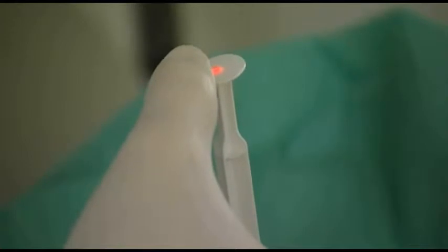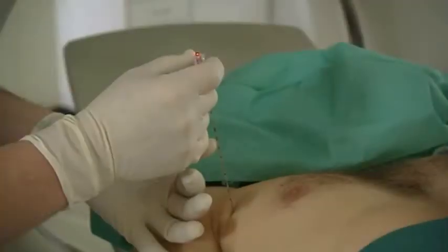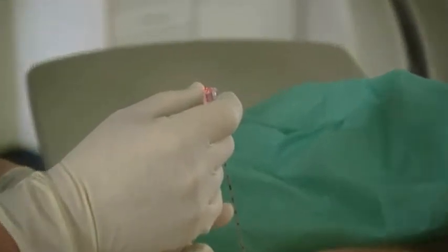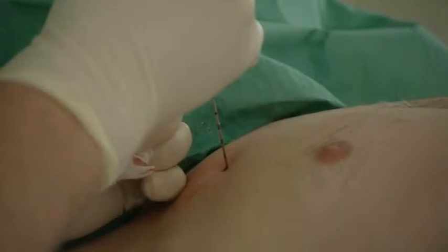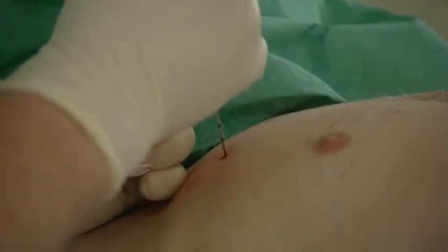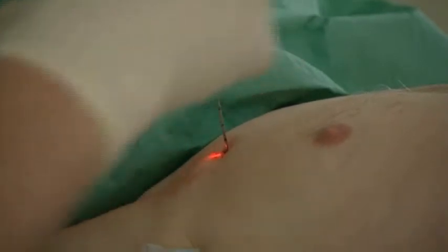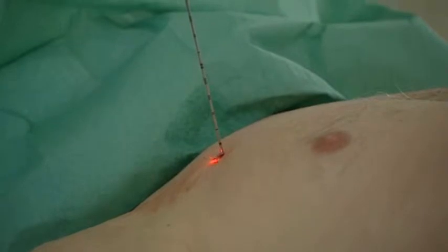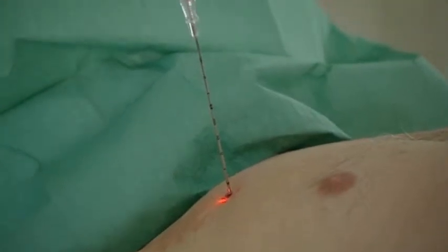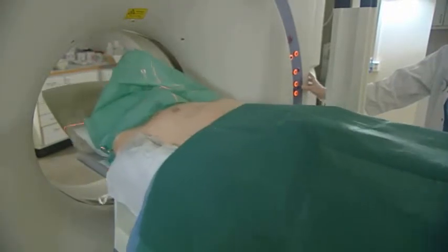Here you can see how first the anesthesia syringe and then the introduced needle is aligned with the laser light when the laser dot is at the hub of the needle. Notice how the needle is advanced in one step to the appropriate depth.